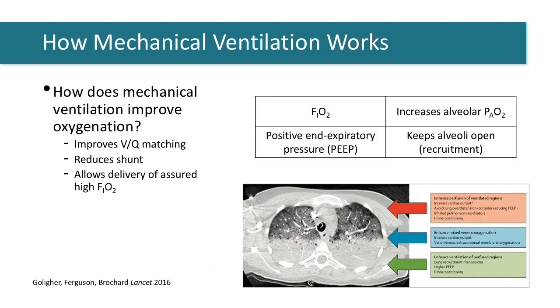The other major task of the mechanical ventilator is to improve and maintain oxygenation. In order to understand how it does this, it's important to understand why mechanically ventilated patients develop hypoxemia. This occurs for a variety of reasons, but the most important mechanism is shunt because of collapsed, non-ventilated alveoli, as represented in the CT scan image shown in the bottom right corner. You can see here two different regions of lung, one open and available for ventilation, and the other collapsed and closed to ventilation.